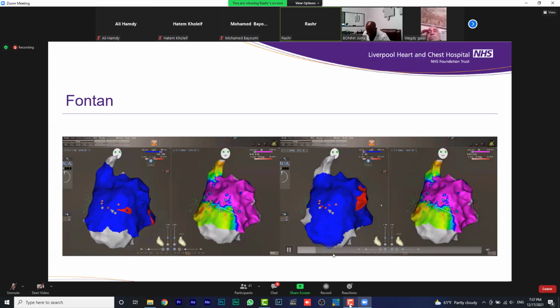After that, we were into tachycardia 2. And so it's just understanding that if you start with one line, you're very likely to get a second tachycardia when you pace, and that you have to think about how you're going to then deal with that tachycardia without completely isolating the atrium and the ventricle from the sinus node, which can be difficult depending on how many lines you may need to draw for the tachycardias.